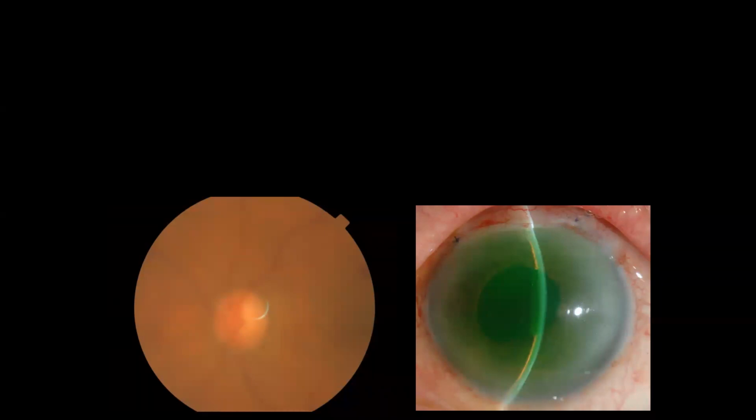In the right photo, I see a slit lamp photo of the eye, which shows a diffusely shallow angle or flat shallow anterior chamber, because it spares the lenticular corneal touch. How would you grade it? Grade 1, 2, or 3? Grade 2. Okay, maybe grade 3 because we don't have a clear slit on the IOL. But grade 2 is fair enough because there is complete contact between the iris and the cornea.